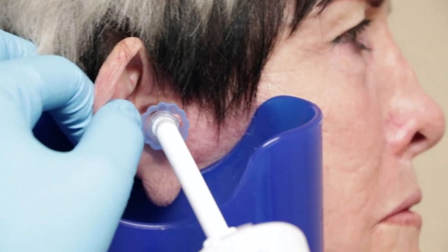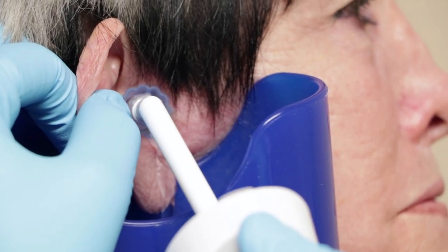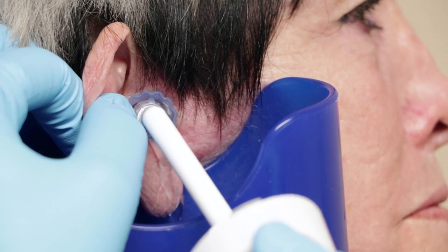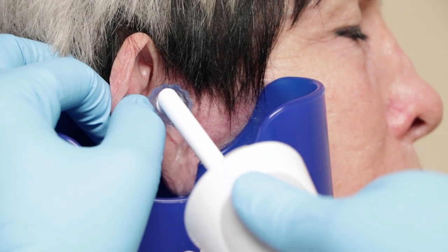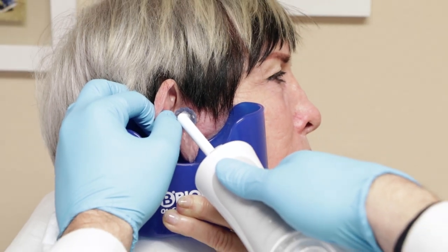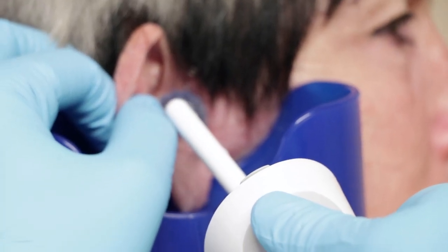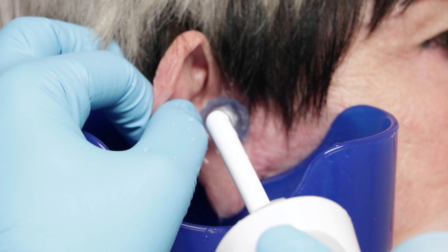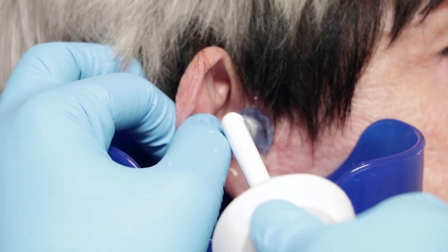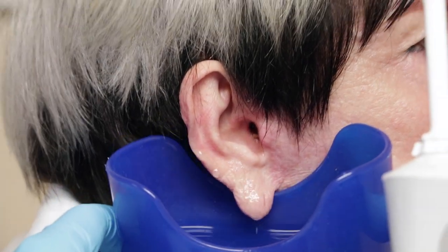All right, get ready for some warm water. Sorry, it's dripping on your arm there. Try to hold it out. Okay, we can see the wax is starting to come out already — wax moving around.